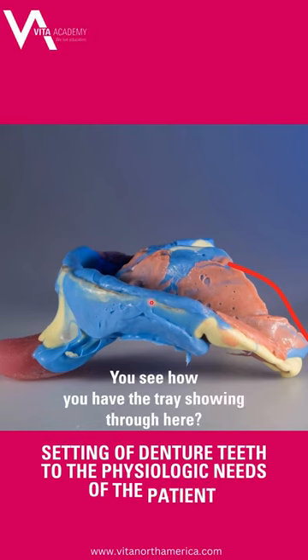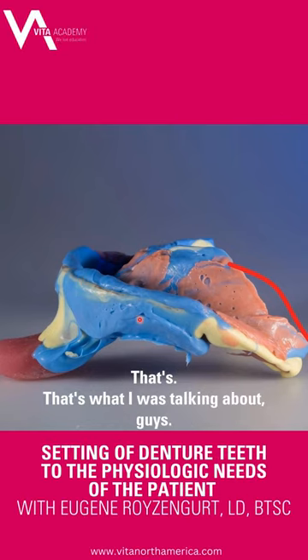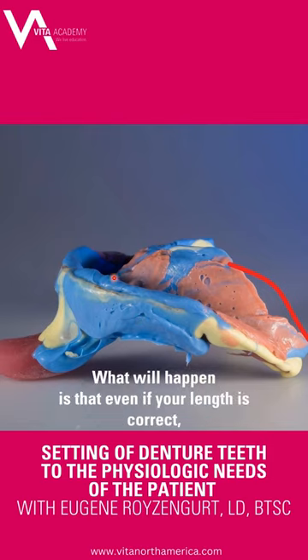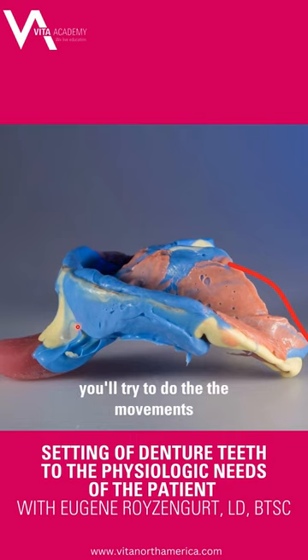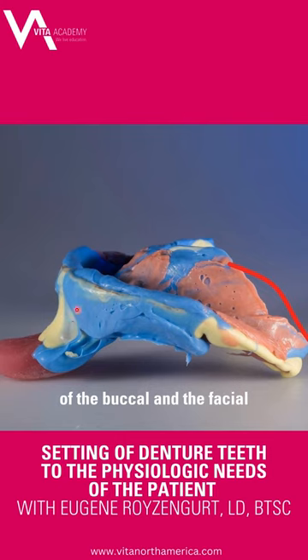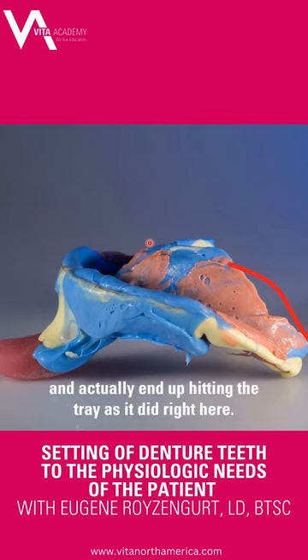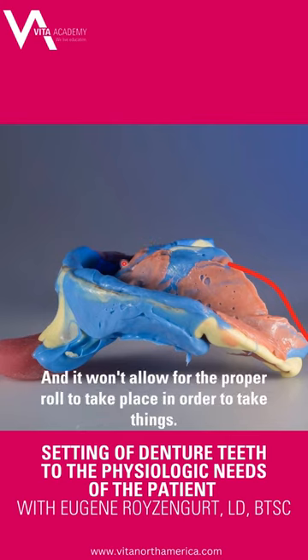You see how you have the tray showing through here — that's what I was talking about, guys. When you use too much block-out on your custom trays, what will happen is that even if your length is correct, you'll try to do the movements of the buccal and the facial lip movements and cheek movements, and it'll actually end up hitting the tray, as it did right here.